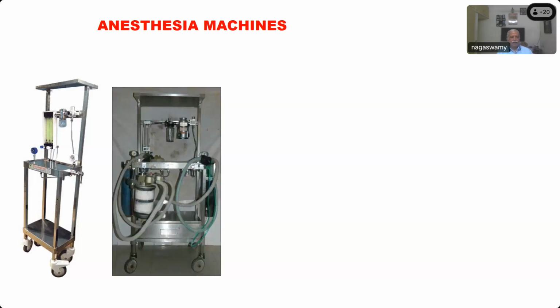Okay, so now what is the difference you find between this machine and this machine? It has got some improvement here. You can now see the 2 pressure gauges here, one behind the other. Can you see that? And what is this? The soda lime canister for the circle system. And you have a flow meter with only 2 tubes, and you have 2 vaporizers. And what is this vaporizer?